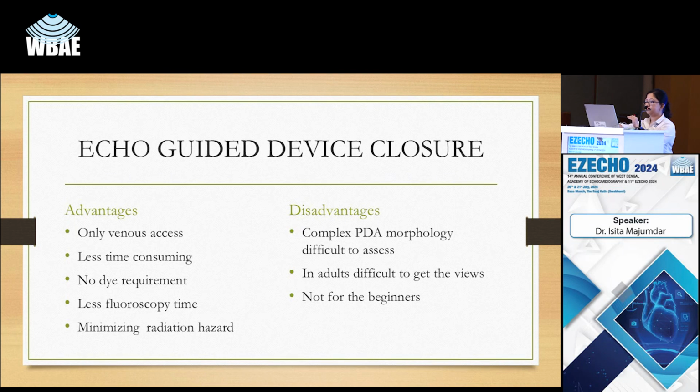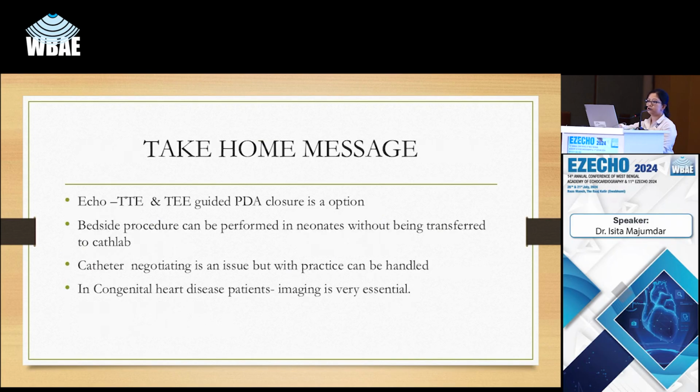Echo-guided device closure advantages: only venous access, less time consuming, no dye requirement, less fluoroscopy time, minimizing radiation hazard. The disadvantages are that complex PDA morphology is difficult to assess, and in adults it is difficult to get the views, where TE guidance could be helpful, specifically when you have to do a closure in pregnant patients. It is not for beginners. Transthoracic and TE guided PDA device closure is an option. Bedside procedures can be performed even in neonates, which is being done in the US and everywhere. Nowadays, catheter negotiation is an issue, but with practice it can be handled.